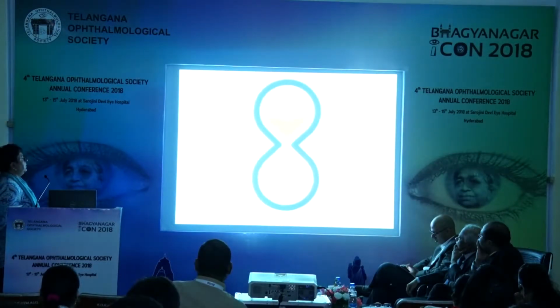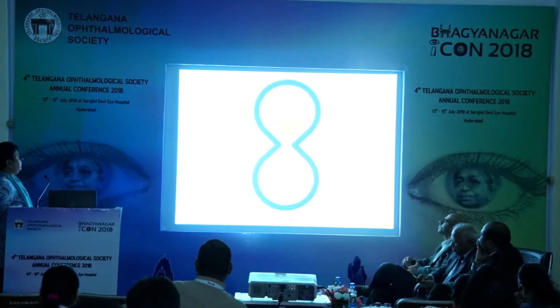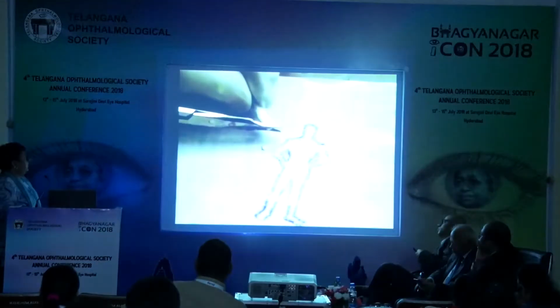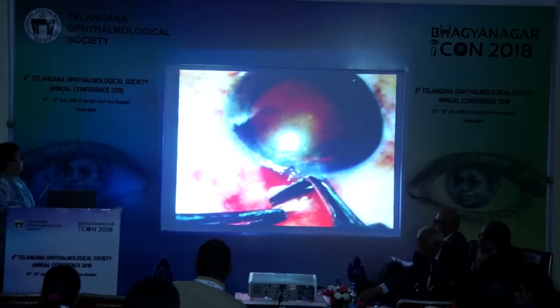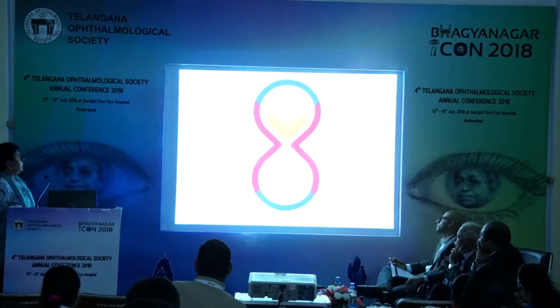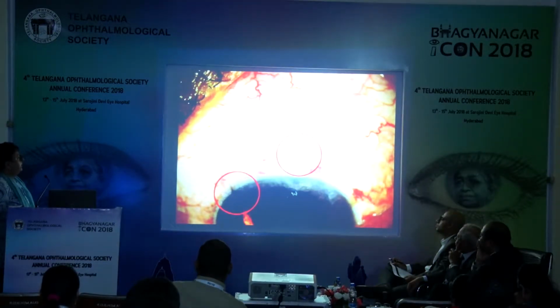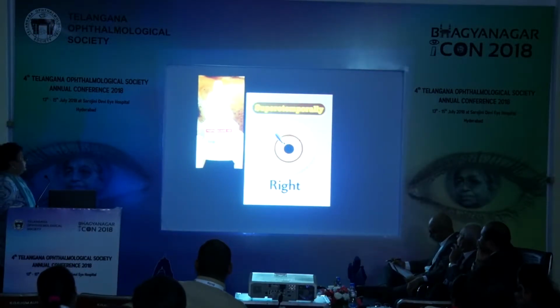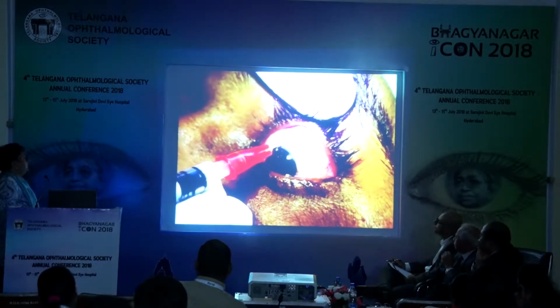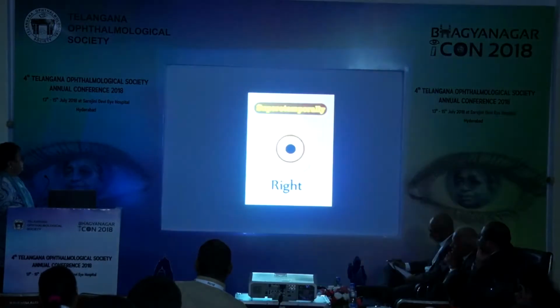The age-old criticism of a separate site surgery has been that it can be time-consuming. This is well addressed by our technique, where time spent around sponge application of mitomycin C is saved. Also, no time is lost in change of surgeon position by twinning the two sides rather than separating them as superior and temporal. Topical phacotrabeculectomy is very much a reality when injected mitomycin C is used in separate site surgery, which is twinned.